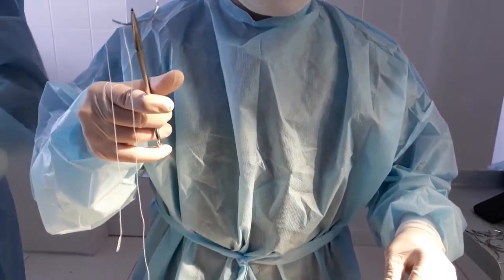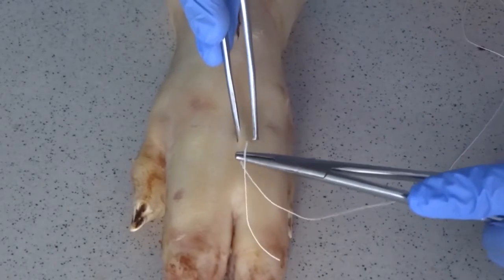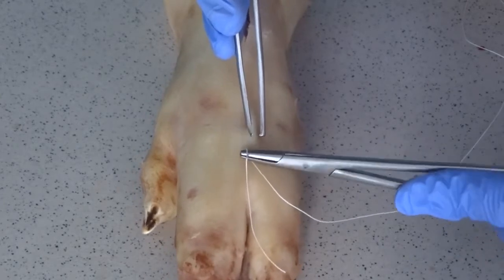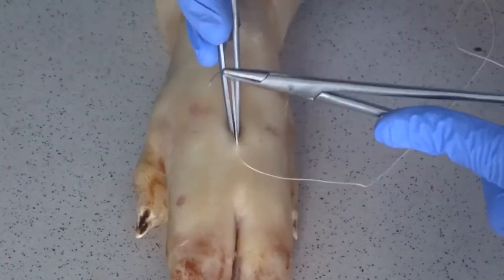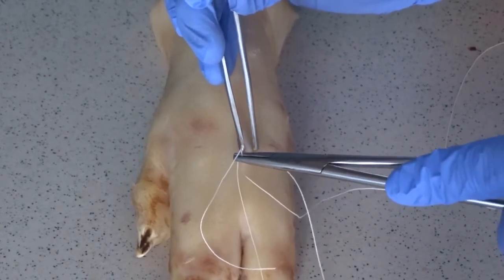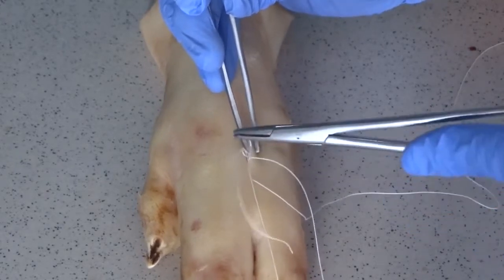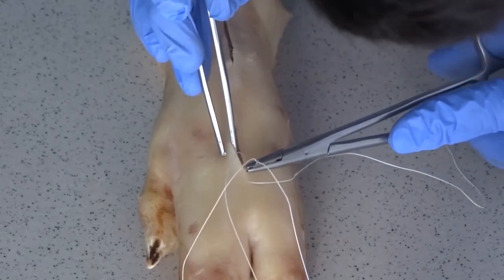The free end of the thread is fixed to the gauze by a knot. The surgeon inserts the needle one centimeter from the edge of the incision. Small bites are taken of the subcuticular tissues in a shallow plane on alternative sides of the wound, with sections of the same length taken on each side. The needle exit point on one side should coincide with the needle bite on the other side.